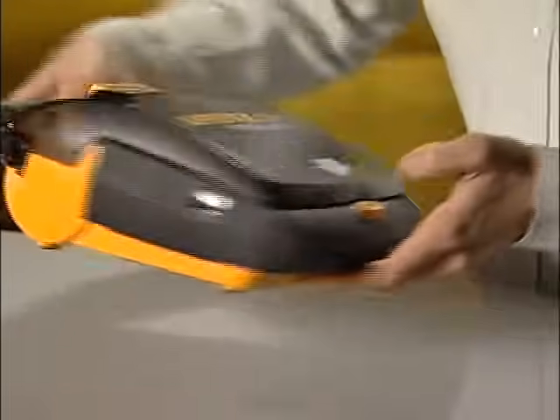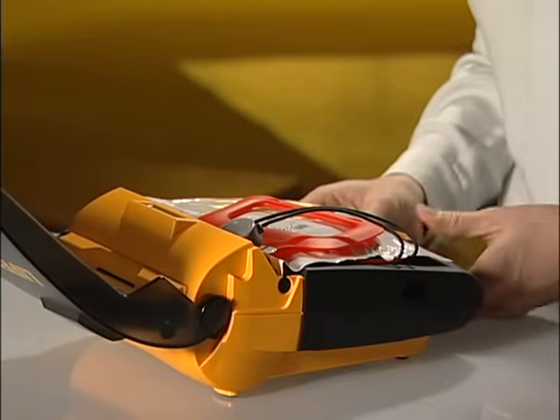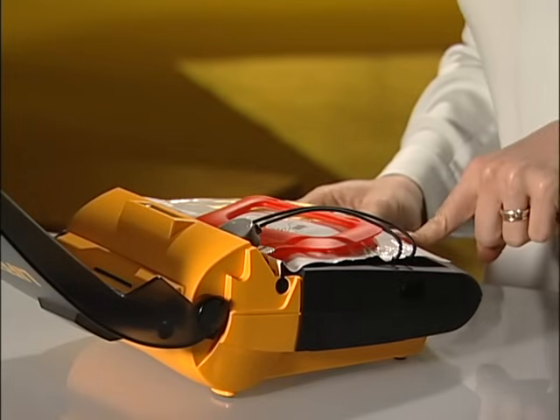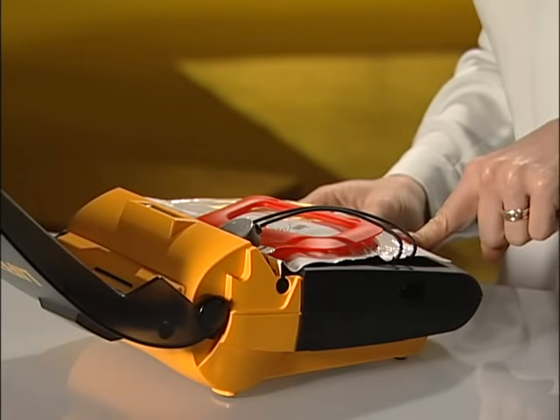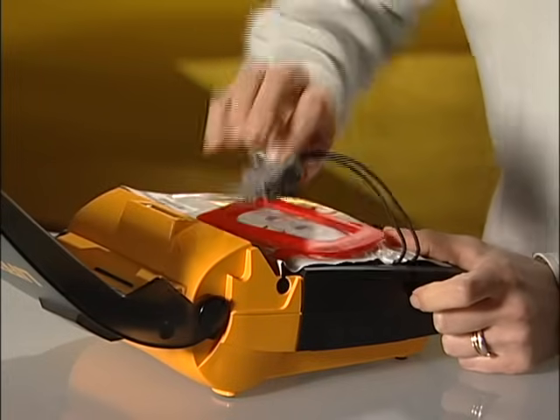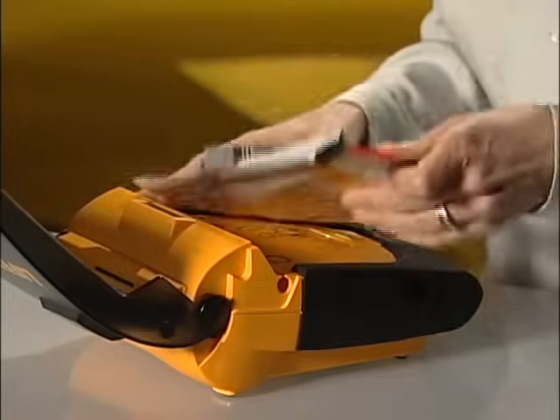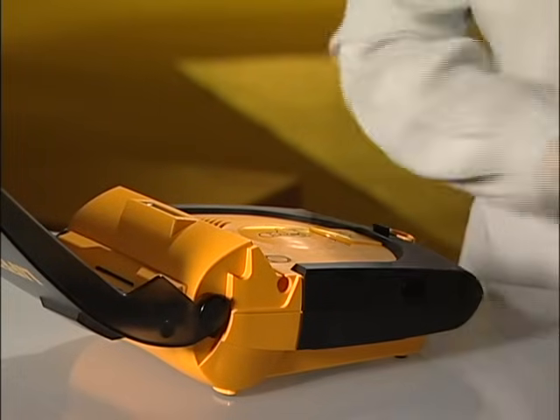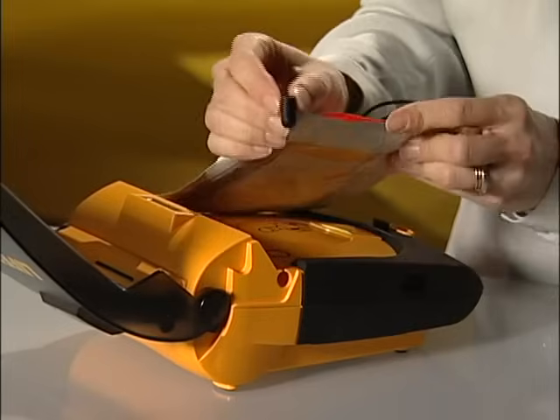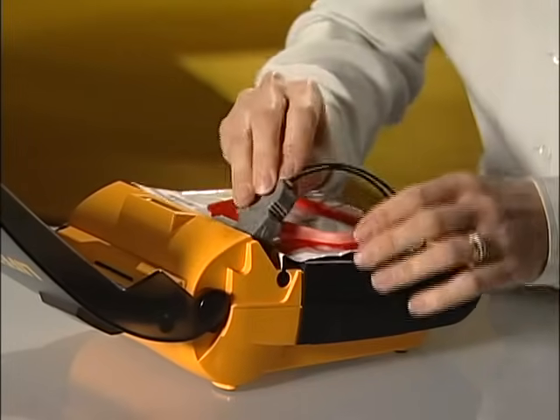Replacing the electrode packet is also easy. Open the lid. "Call for help now." Hold down the on-off button to turn it off so you don't use up the battery. Now disconnect the electrode plug like this. Slide out this little pin here and throw away the old electrodes. Put the pin from the new electrode packet back into this same slot here. Plug the connector in.